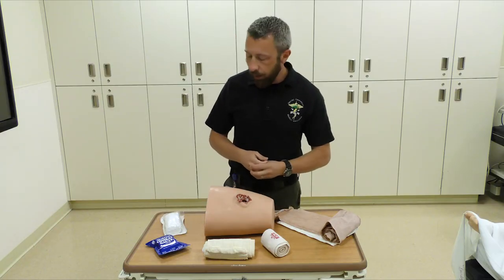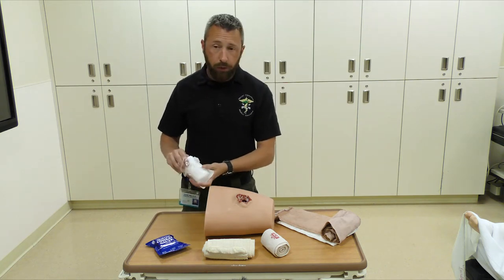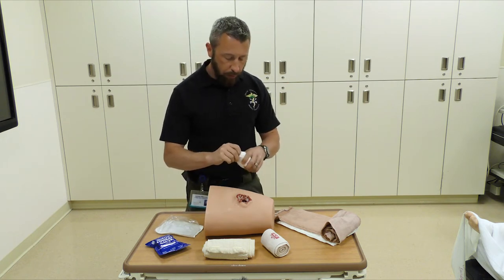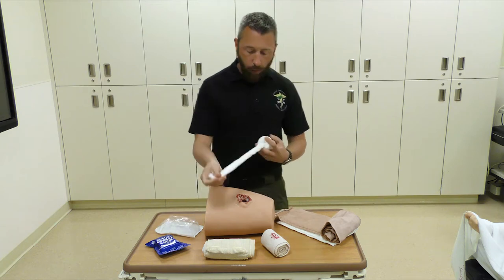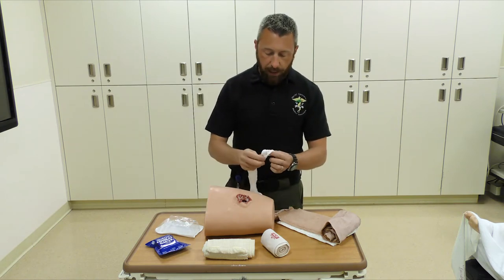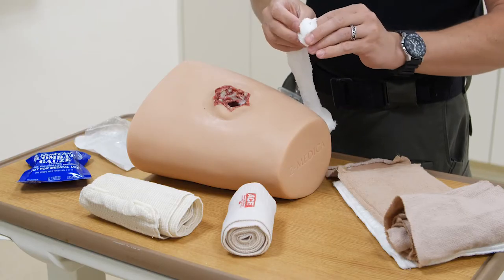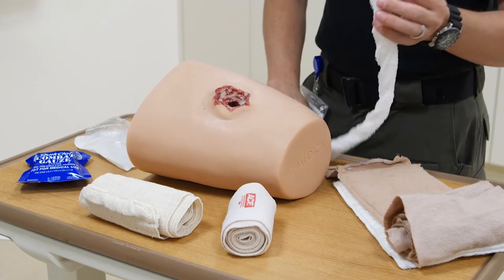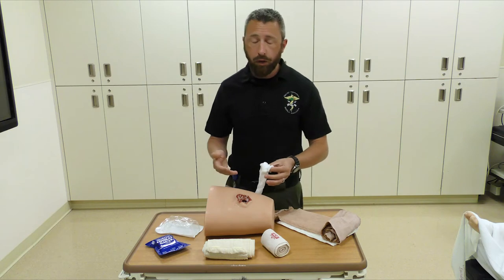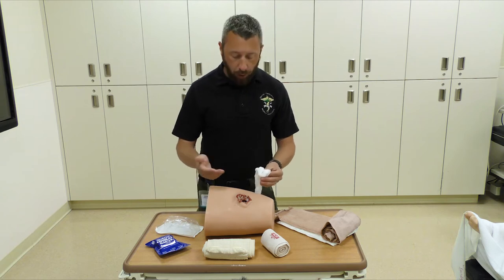Two types of products. If you don't have a hemostatic agent, regular rolled gauze is fine to use. In the military, we were taught to pull the gauze from the inside out and feed it from there. Wound packing is very simple. I always tell people to use their non-dominant hand — and we would be wearing gloves if available. You want to wrap the front of your finger, because inside the wound channel there may be bullet jacketing, fragmentation from an IED, or bone fragments, so you want to protect the front of your finger.